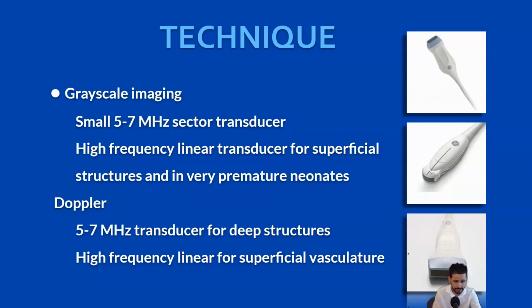All right, so probe choice. Now, when you're doing neonatal neurosonography, you want to use a high megahertz transducer to get good resolution. And we have small probes that are just for that, like the sector, that goes up to 10 megahertz. My favorite are these little curved ones, the microconvex array transducers. They're usually from 3 to 10 megahertz. They take very, very good images, much better than the sector probes, in my opinion. And then finally, linear probes to get those really nice high resolution images.